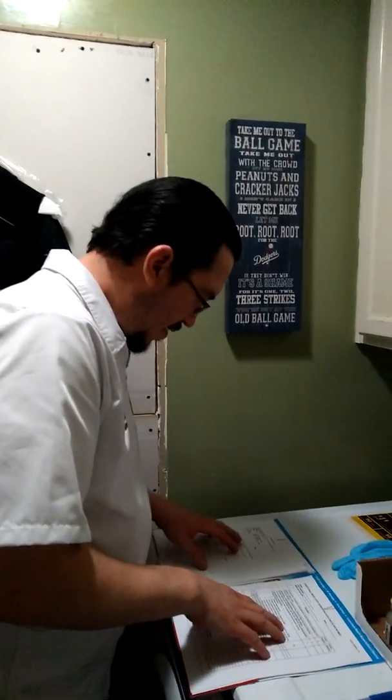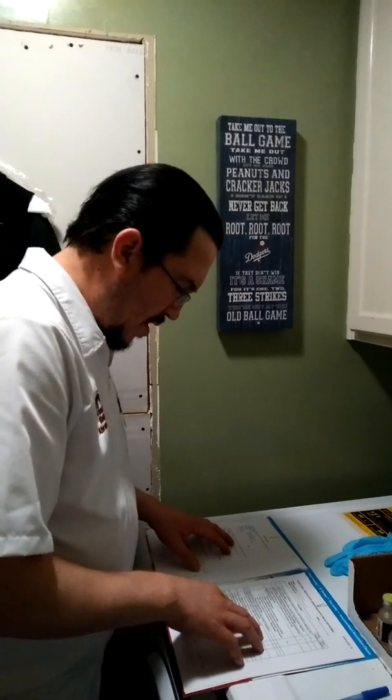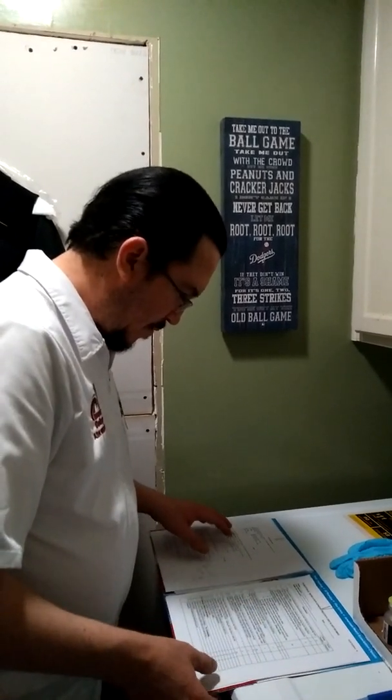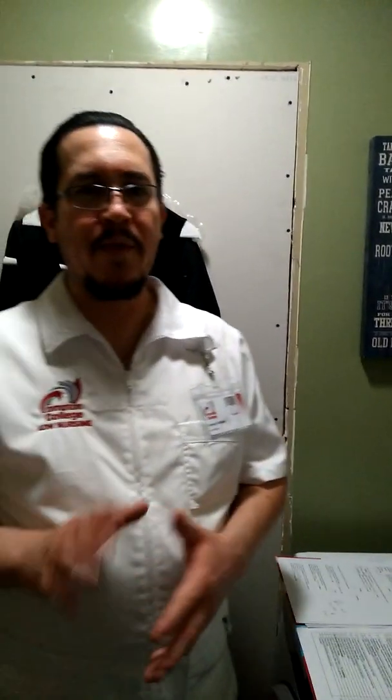For example, respiratory rate for opioids, and blood pressure for antihypertensive medication. Check. No, everything looks good. I believe it won't interact with any of the conditions of the patient. Everything looks well. Next, I'm gonna prepare medication.